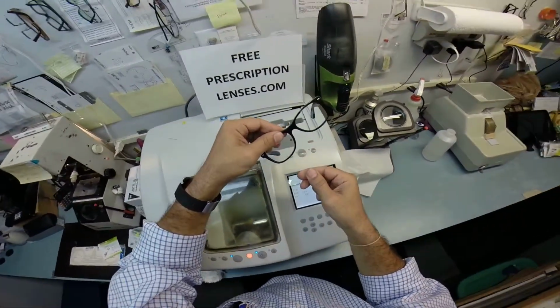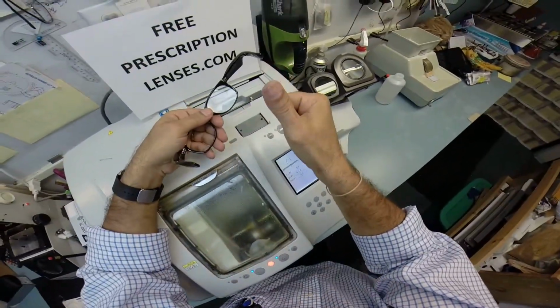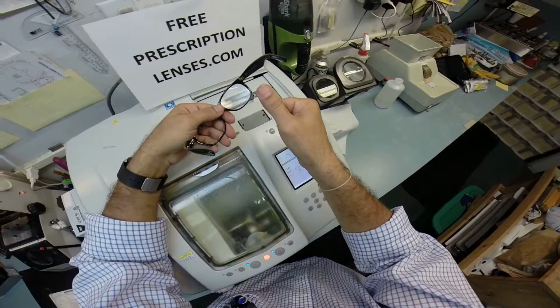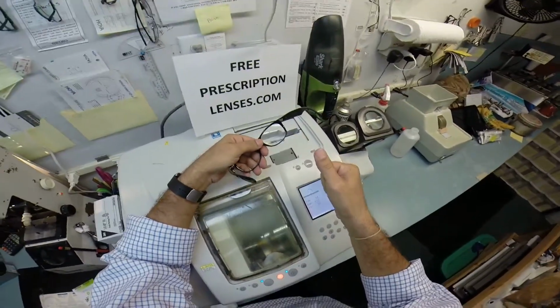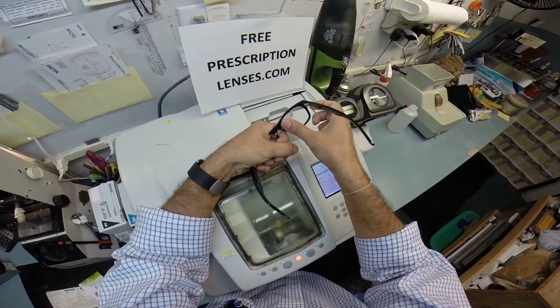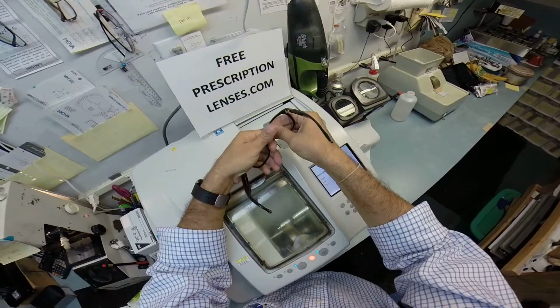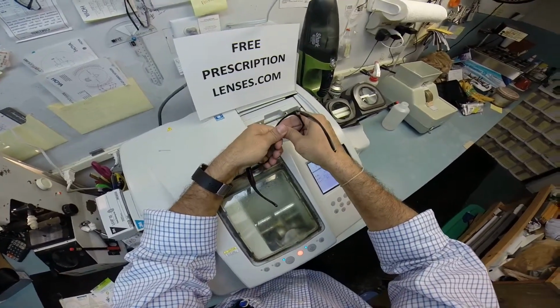Now, in order to take them out, I flip the frame over. You're always going to use your thumb. You're always going to push down with your thumbs, no matter whether you're putting them in or taking it out. So, I'm right-handed, so I grab the frame in my left hand. I put my thumb at the nasal corner. I grab the lens on both sides so I don't drop it. But I place my thumb on top of my other thumb and I push down.